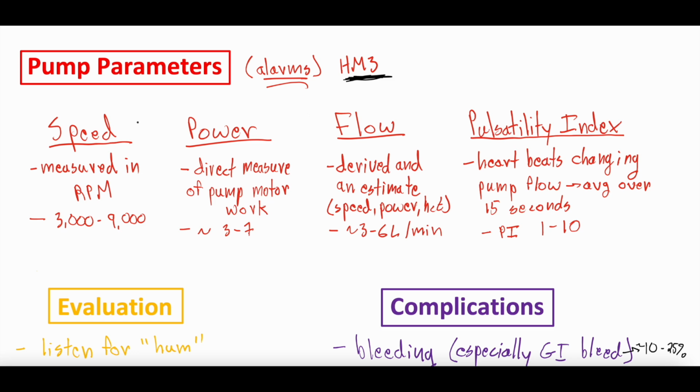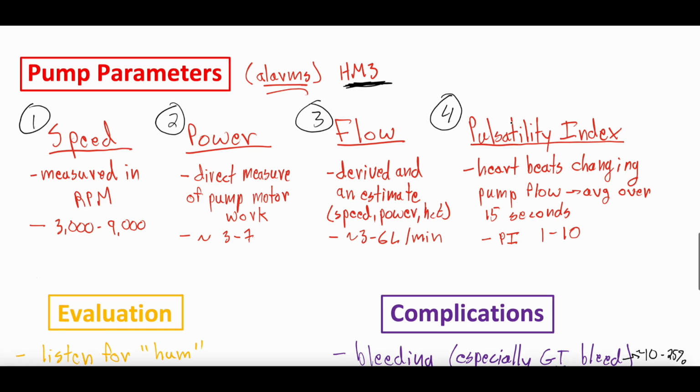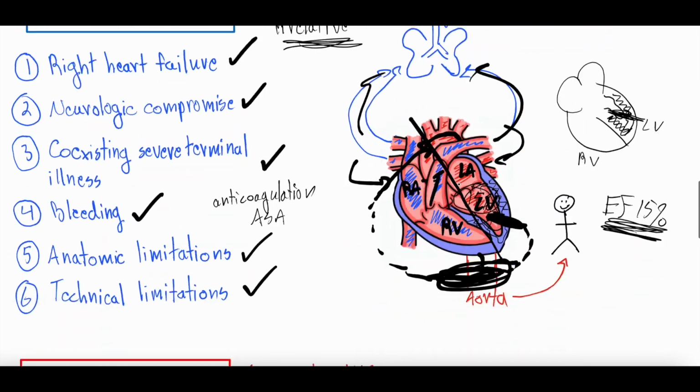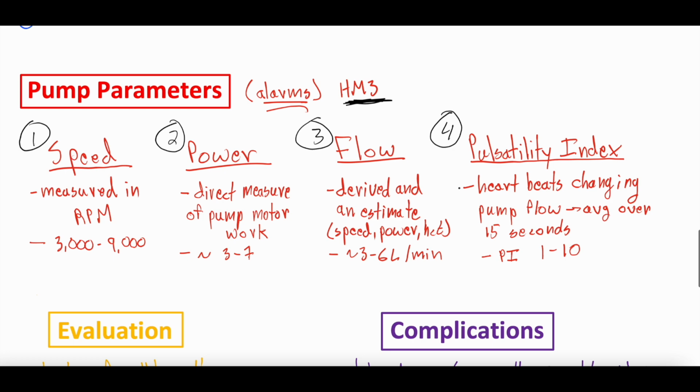So the pump parameters, there's 4 pump parameters, all right? Speed, power, flow, and pulsatility index. And these are literal things on the LVAD itself, right? I'm going to scroll up. We said LVAD patients have this external control unit, right? These 4 parameters are on this external control unit. You can get them from that, okay? And they're relevant to how the LVAD is working and the physiology going on in the patient's body.